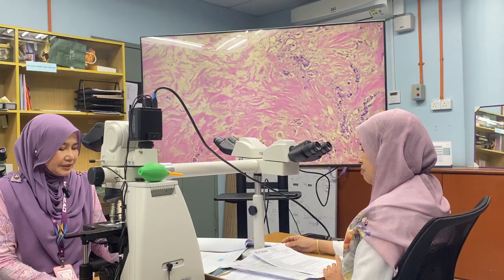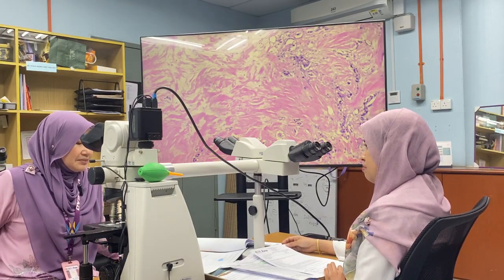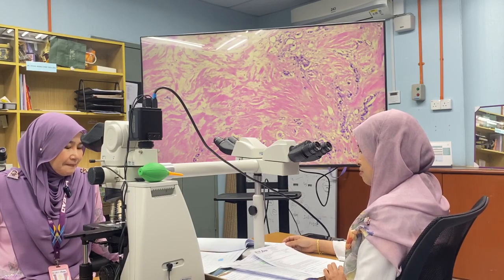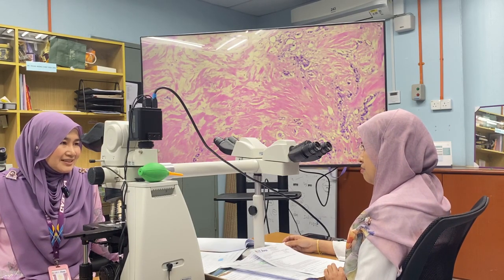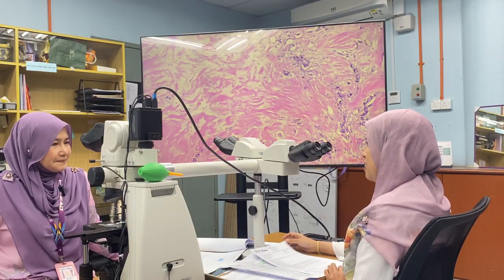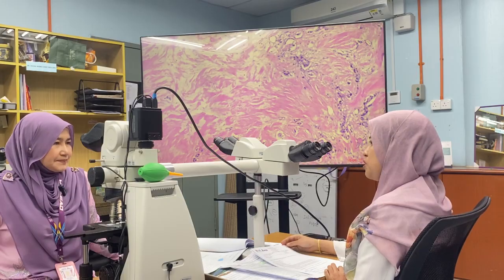All right. Okay. Maybe one last question, because you have not mentioned the tumor marker. Yeah, I know that this case is ER/PR positive previously, right? And HER2 negative. Do you think that we need to repeat the tumor marker for the post chemotherapy specimen? Yes, we need to repeat because the tumor can have a different expression post chemo.